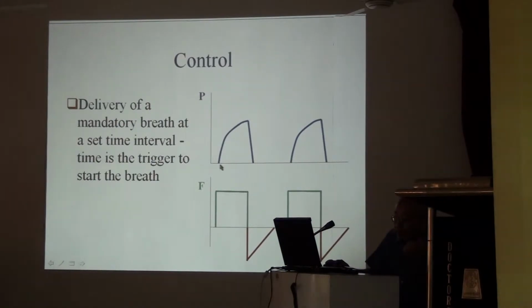Now another thing. The pressure curve shows like a sinusoidal, but actually the patient is getting a square wave flow pattern. Because of the high velocity of flow, it goes like this. Then the peak pressure is maintained here. So it is a square curve. So you need to look at both curves, pressure and flow, at a time. Then only you can understand what is happening.